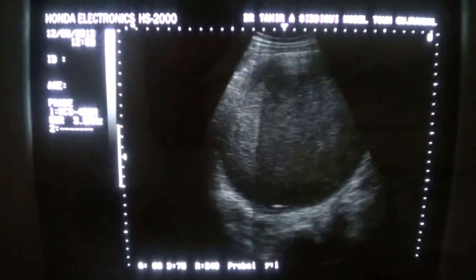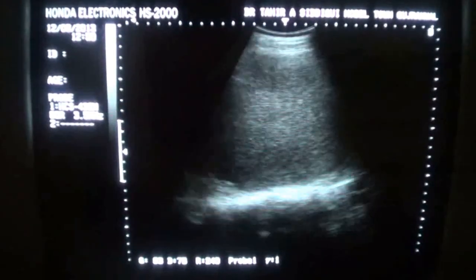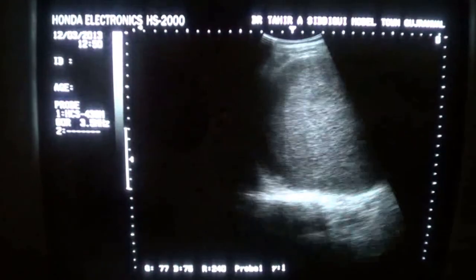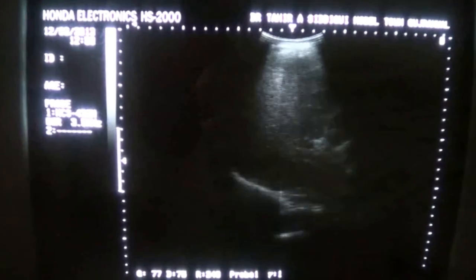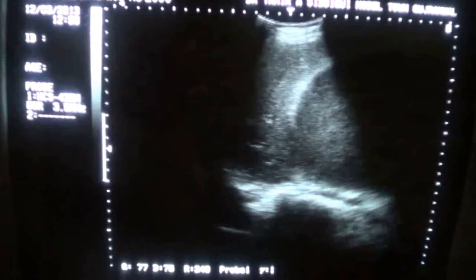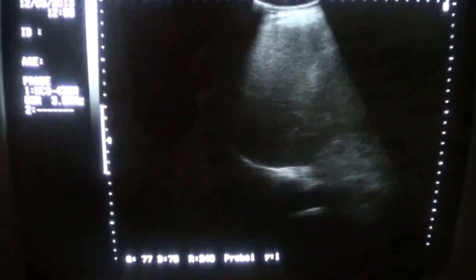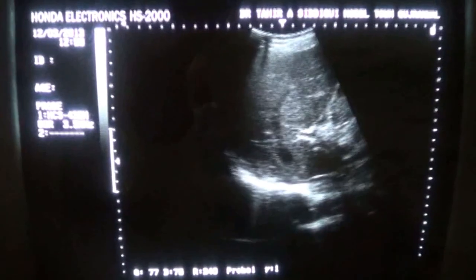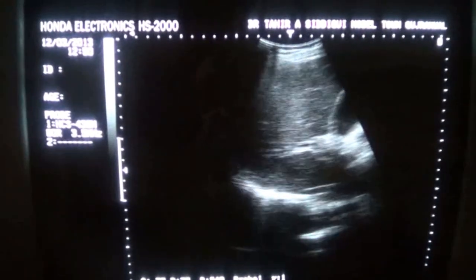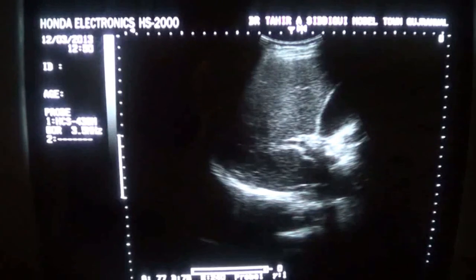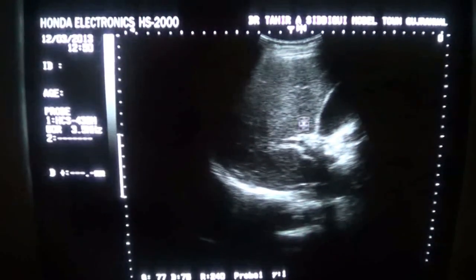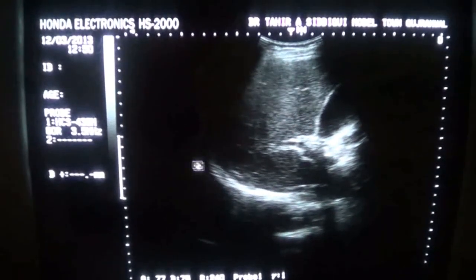Adjacent to the right lumbar region. Now this is the liver. Let's see if it is intraperitoneal or extraperitoneal. Here you see the liver — let's explore the liver and the gallbladder. This is the liver, normal liver, normal diaphragm.